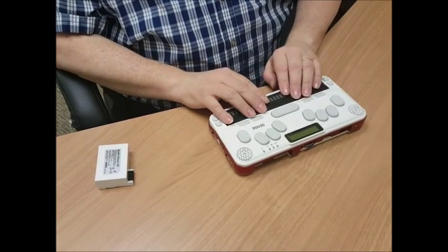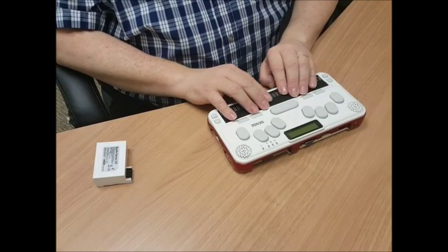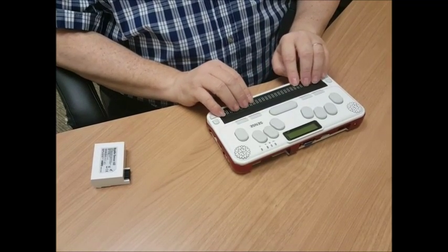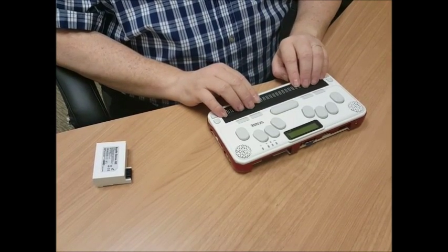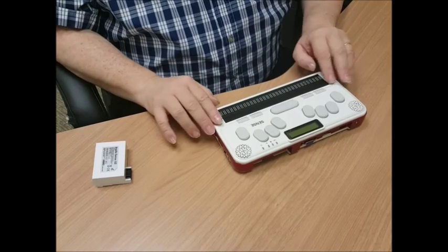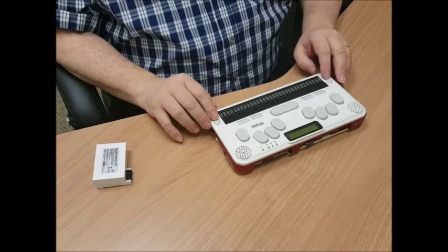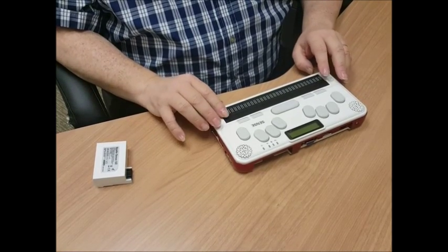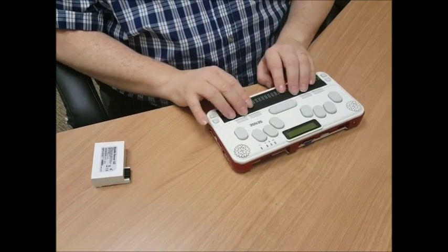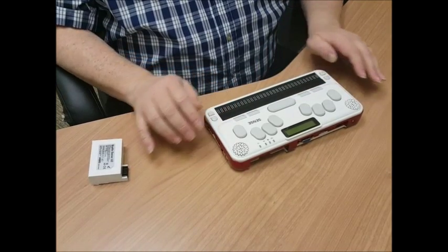Then we get to the Braille display. So we have 32 cells on this unit. On each side of the unit are up scroll and down scroll buttons. And above each and every cell is a cursor router key.